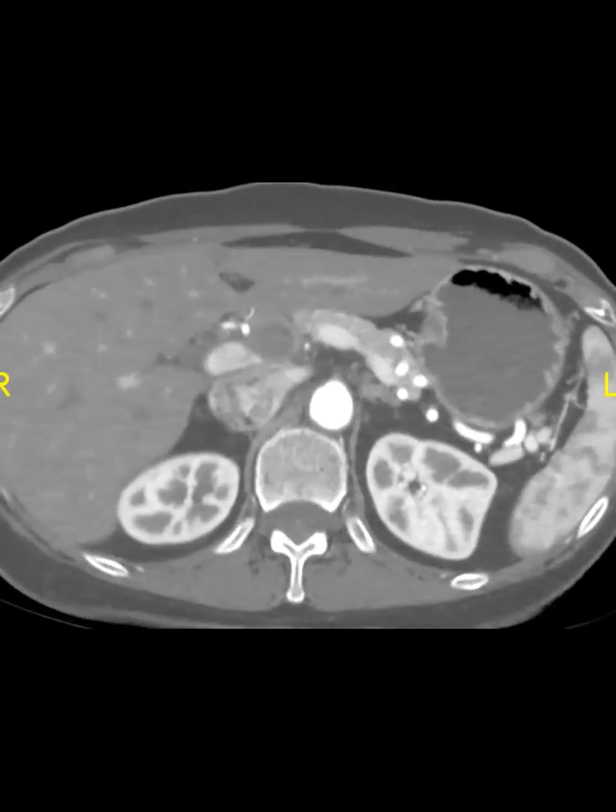Cool. I've seen a few of these now. I think it's interesting. We definitely have to think about that and bring it up, because if they're going for biopsy, you don't really want to biopsy a pseudoaneurysm. Luckily, it sounds like that EUS FNA didn't hit it, or it was already thrombosed.